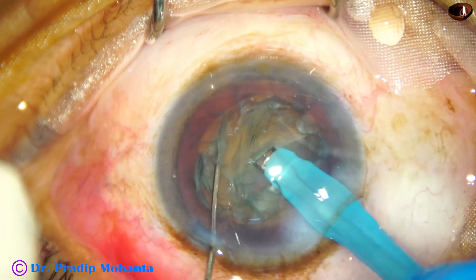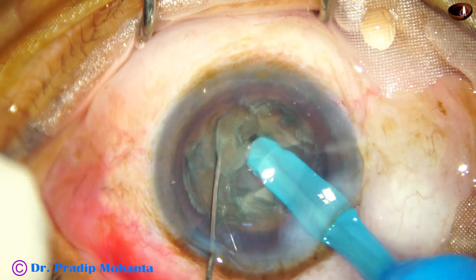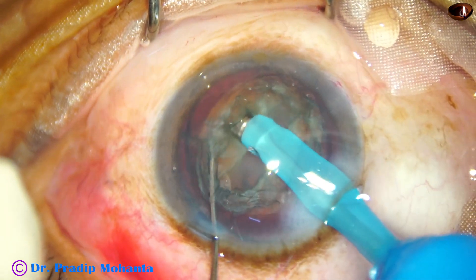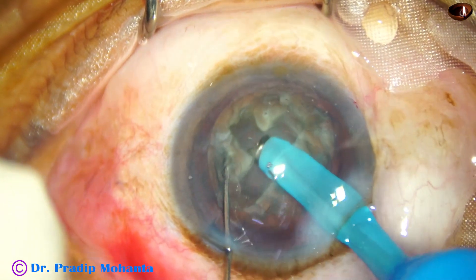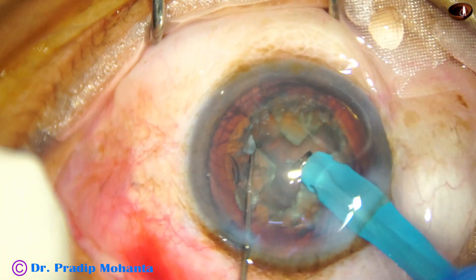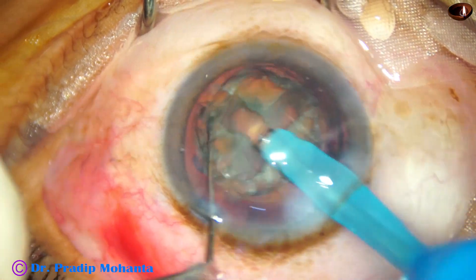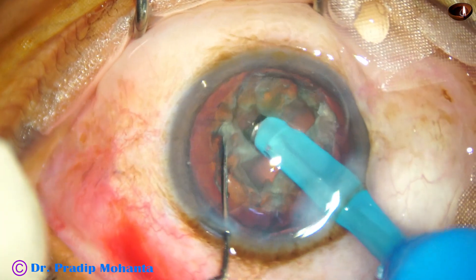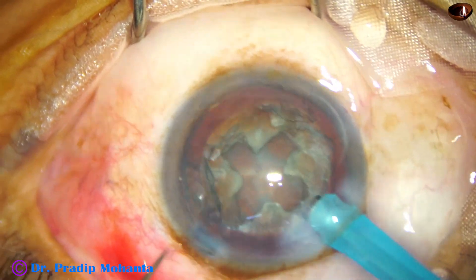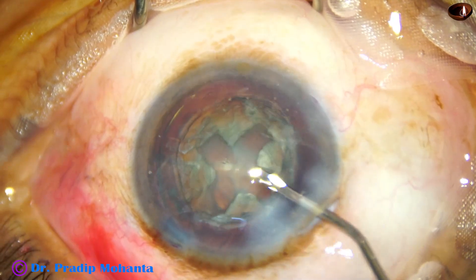Now 90 degrees away, make a groove on this hemi-nucleus. The technique being demonstrated here is the divide-and-conquer technique of phacoemulsification. The groove is deepened so that you can see the red glow at the floor of the trench. Now you can use the phaco needle tip and the chopper to divide.